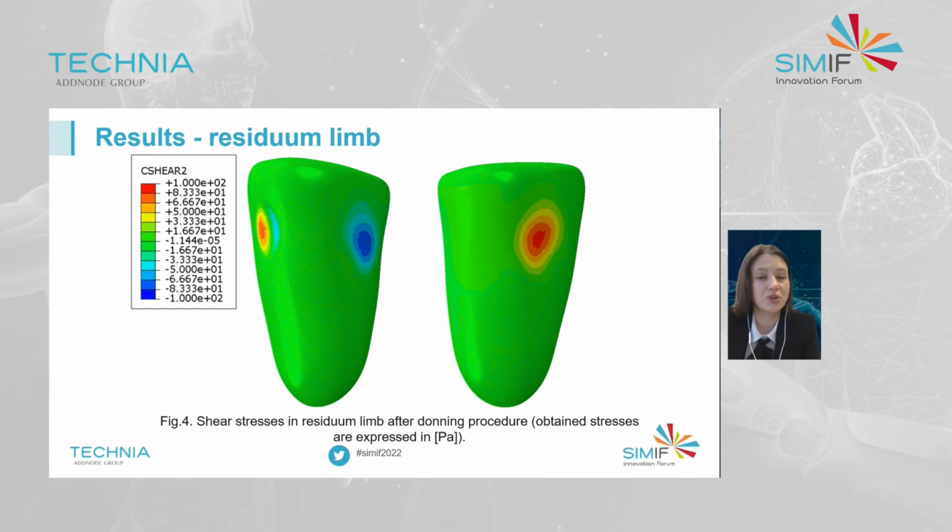Circumferential shear stresses are shown on the slide, and the evaluation of shear stresses is important from the point of view of prosthetics. The prosthesis aims to achieve limited socket-residuum shear load transfer to protect the residuum distal tip from end bearing while avoiding excessive shear that might increase the risk of, for example, skin breakdown. As such, accounting for different sources of shear loading in the model is of particular importance for clinical transfer.